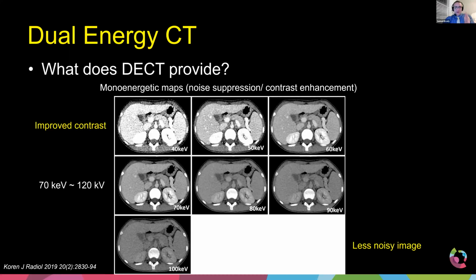I tell them this is probably one of the most important, this is one of the main reasons why I would use dual energy in kids: the fact that you can get 5 or 6 or 7 different views, or looks, or different types of ways to look at that child's image, but for the price of just one image.